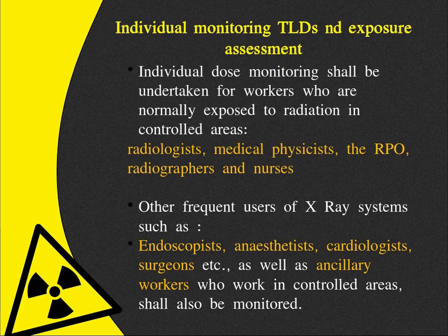Okay, now we go to the TLD part, the thermoluminescent dosimeters, which are the individual monitoring devices for exposure assessment. Individual dose monitoring shall be undertaken for workers who are normally exposed to radiation in controlled areas, like radiologists, medical physicists, the radiation safety officers or radiation protection officers, radiographers and nurses.